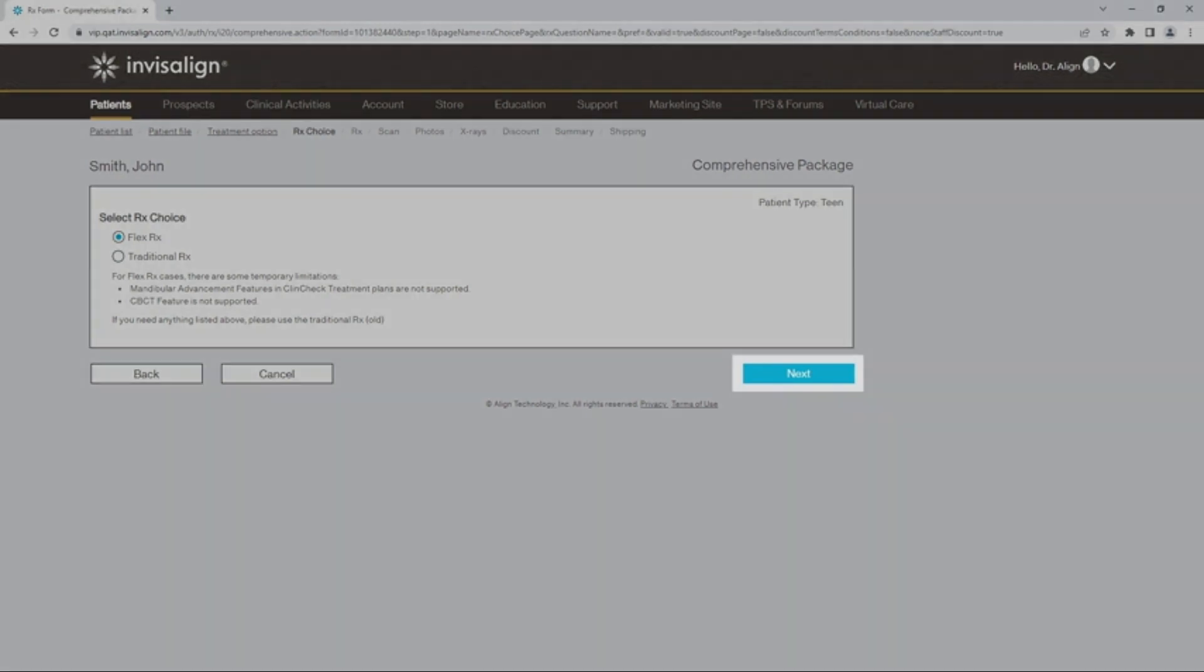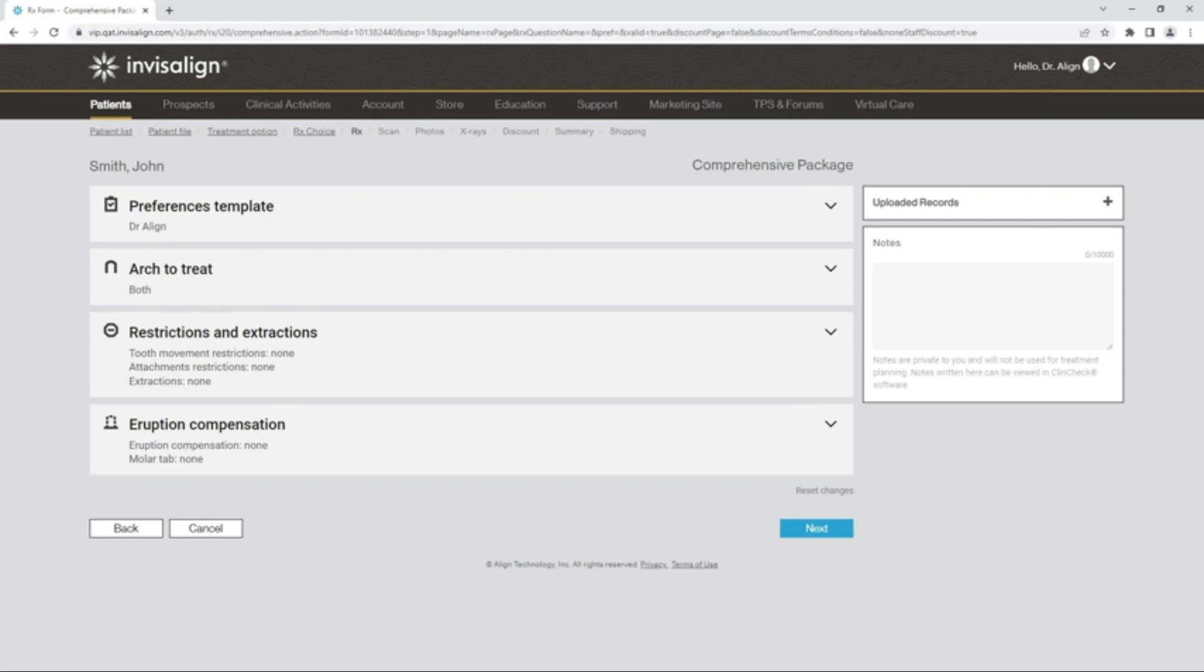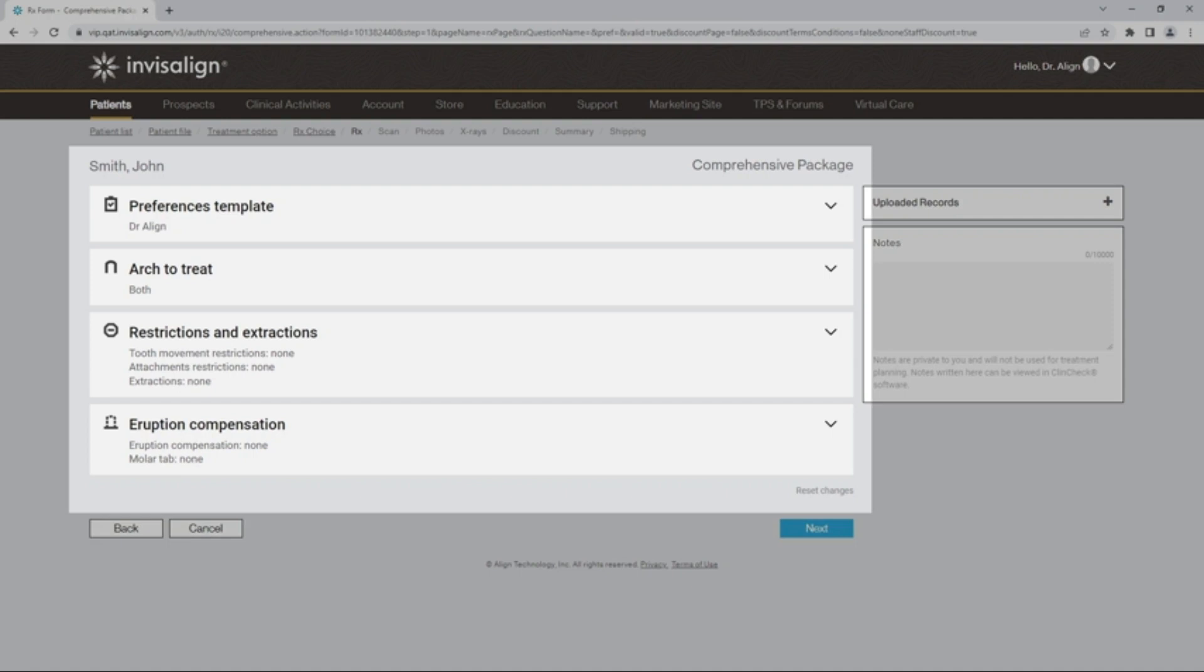As you click Next, you will see the changes in the FlexRx prescription form. The simplified prescription form is now visible in a single webpage. You will notice four questions, each with a collapsible section.